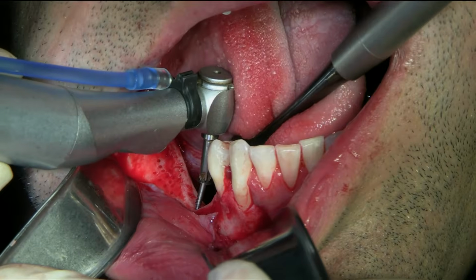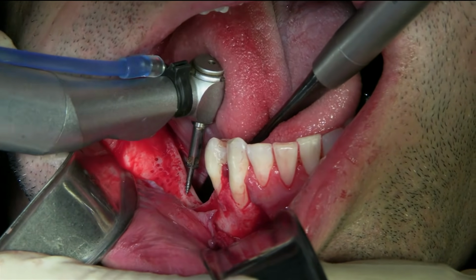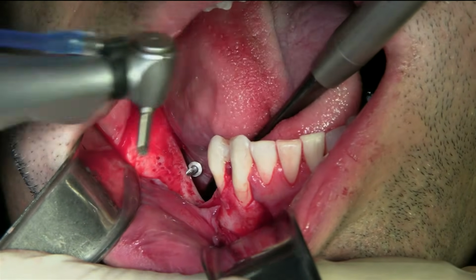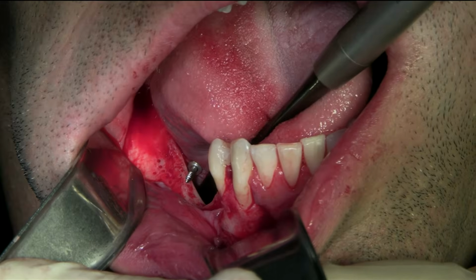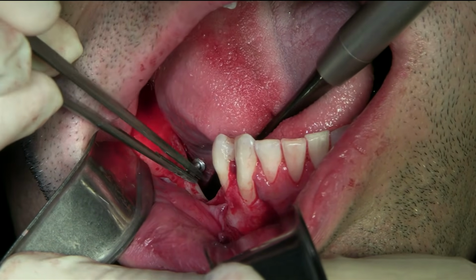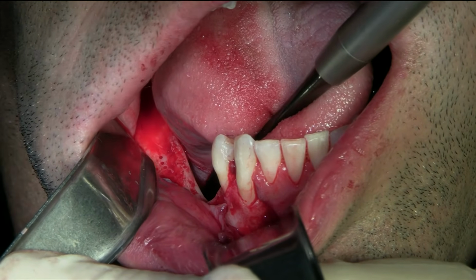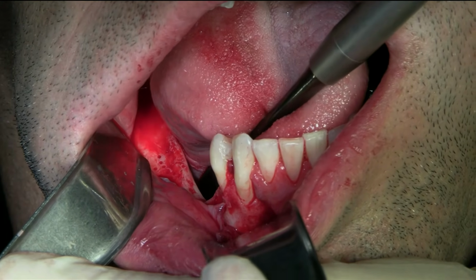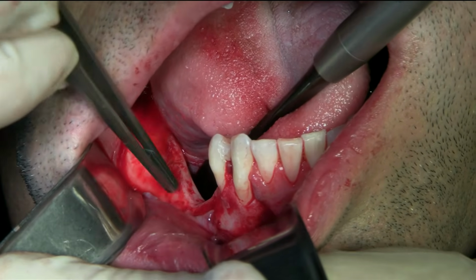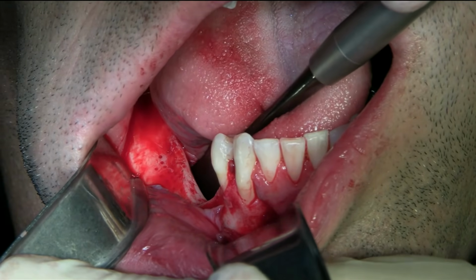What's the tallest 10 screw you have? This one is too short. There is a 10, Bella. This is 10. Give me a. This is 10, Dr. Joy. That's not a 10. You give me something taller. Maybe it's in the incorrect slot.